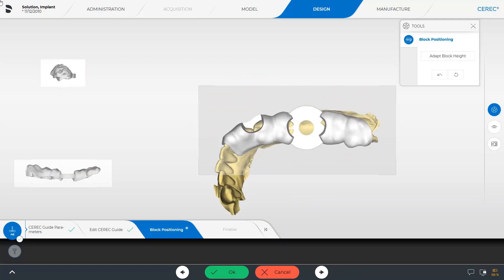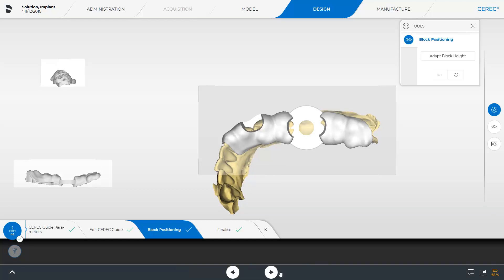In our case, we discard the new position and, provided no further modifications were needed, could now move directly to the last phase, the Manufacture phase.